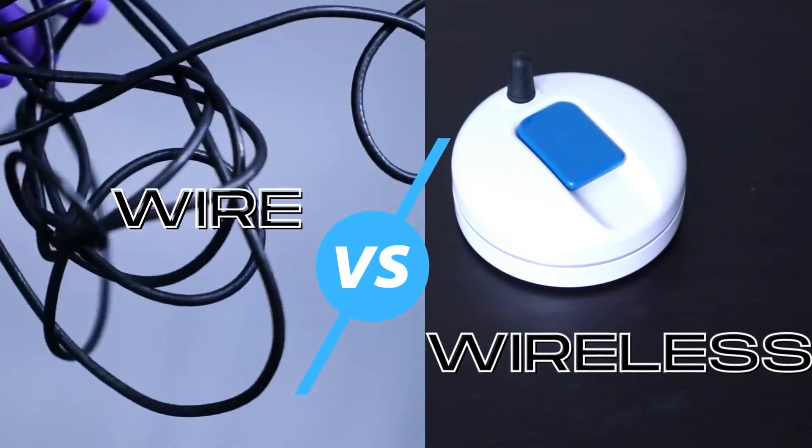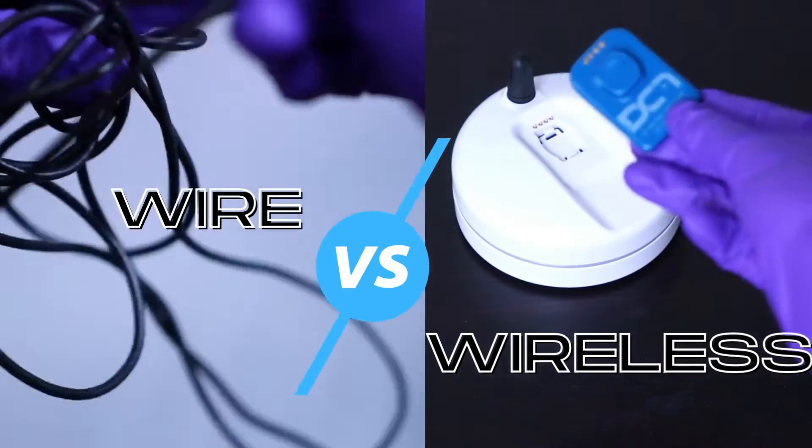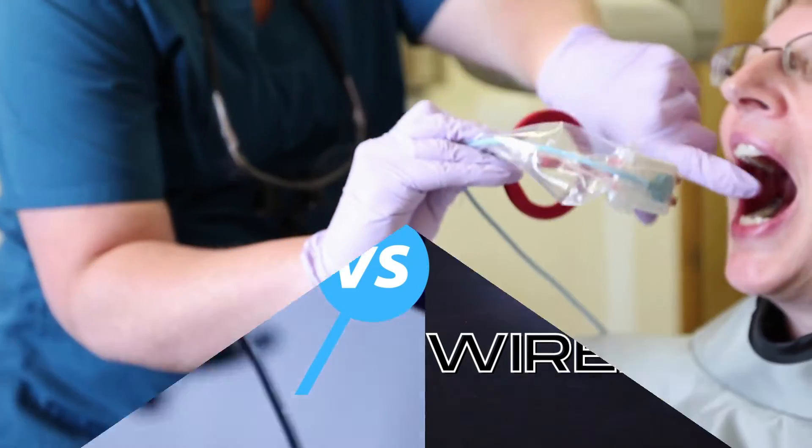Number one is wired or wireless sensor. The traditional wired sensor has long been the standard of practice since the first digital x-ray sensor came on the market in 1999.